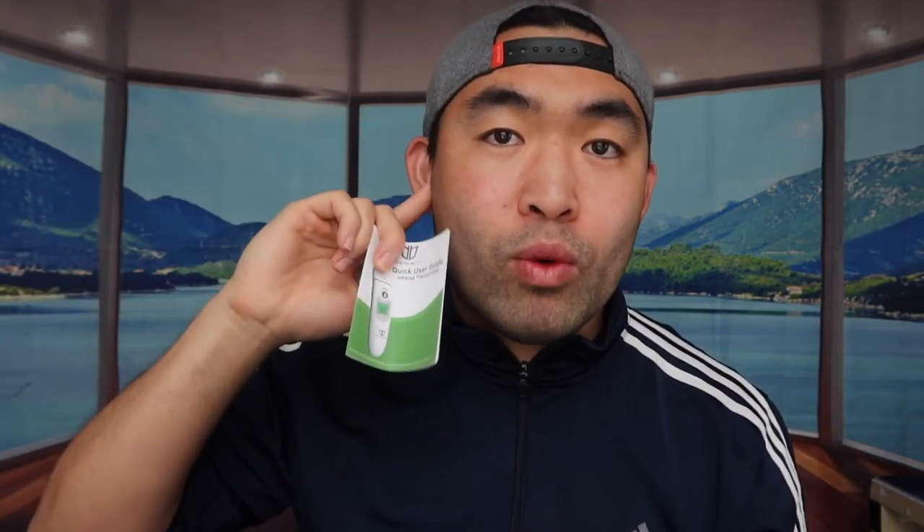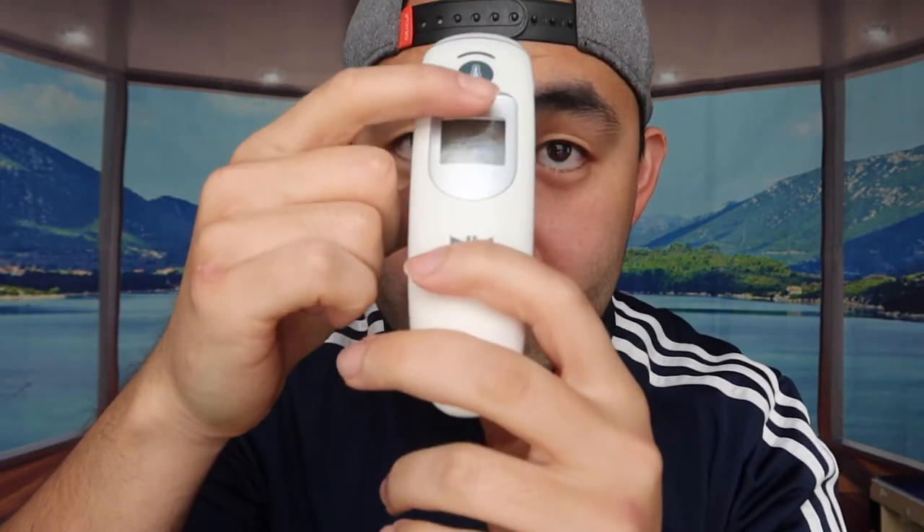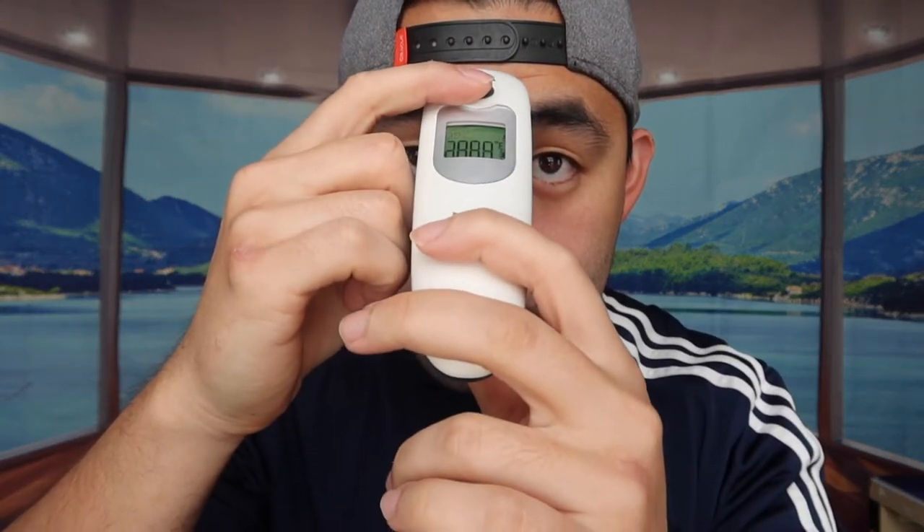Let me show you the other two as well. This one comes with an instruction manual that covers both the infrared forehead option and the ear option. It also comes in a little carrying bag. For all these infrared thermometers, the battery compartment comes open — they don't pre-install the battery. This one uses two AAA batteries, and so does the next one.